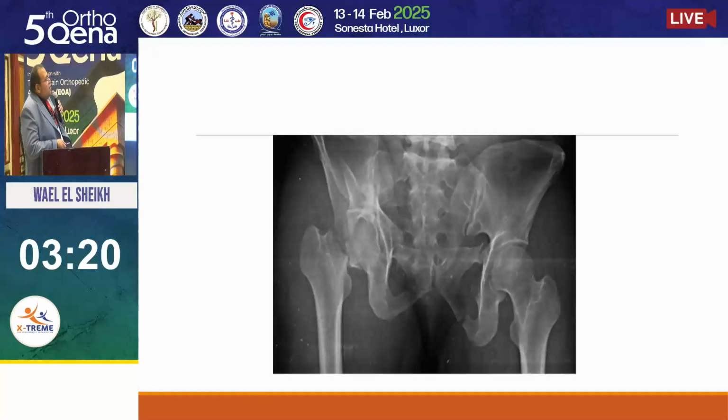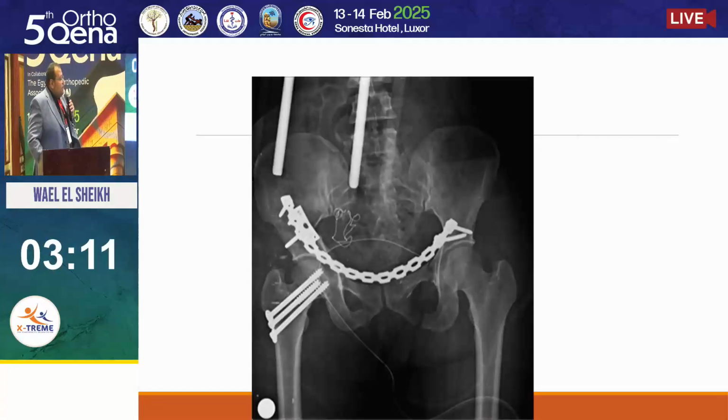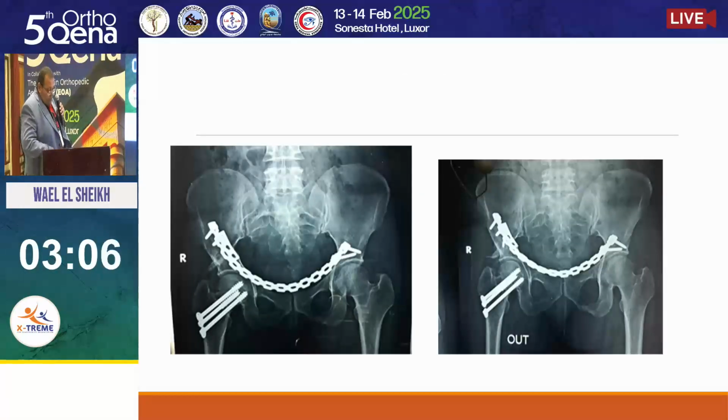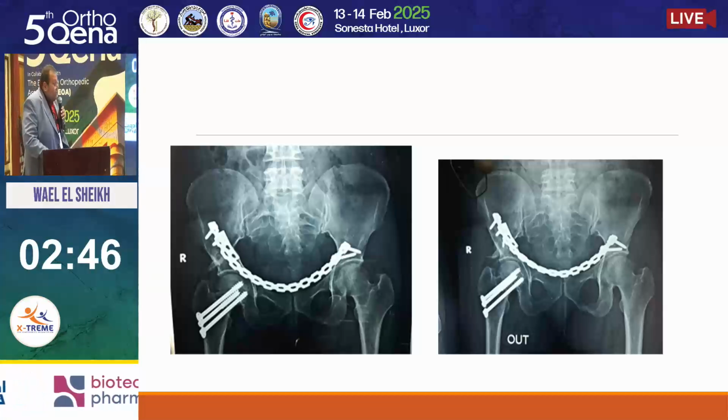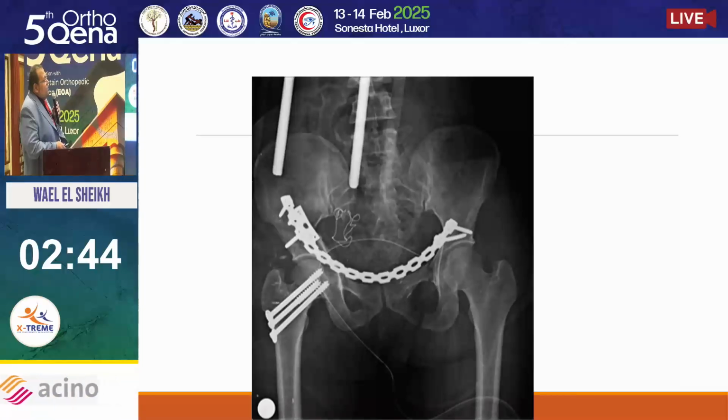Another case, a very high energy trauma associated with a fracture of the femoral neck and bilateral superior and inferior pubic rami. In such a case, we also did long segment fixation. This is 3 years post-operative. Healing is adequate, but the main drawbacks of such surgery are that it is lengthy, with increased blood loss, associated comorbidities for the patient, and injury of important structures. If you recognize, this X-ray is 3 months post-operative.